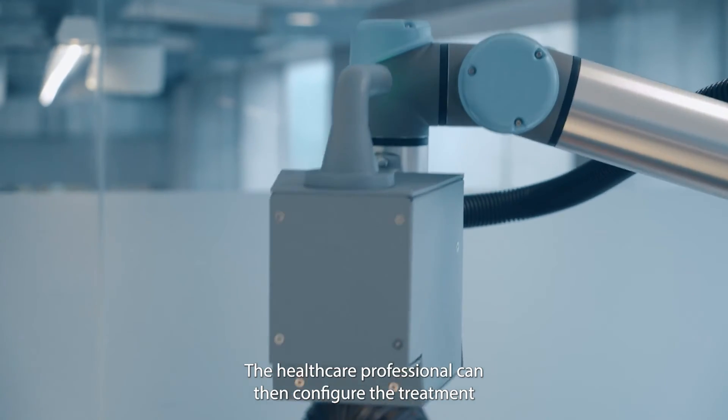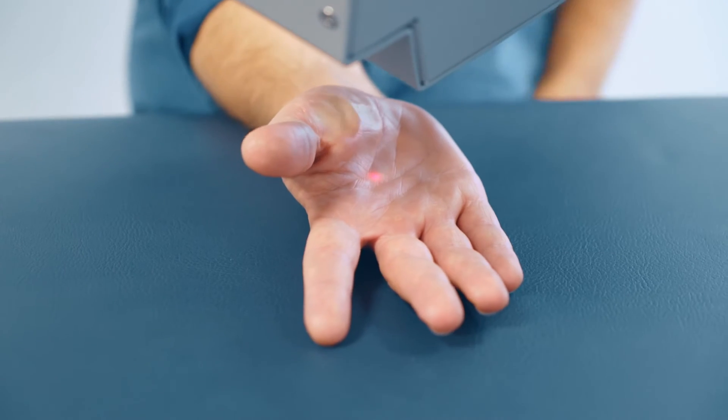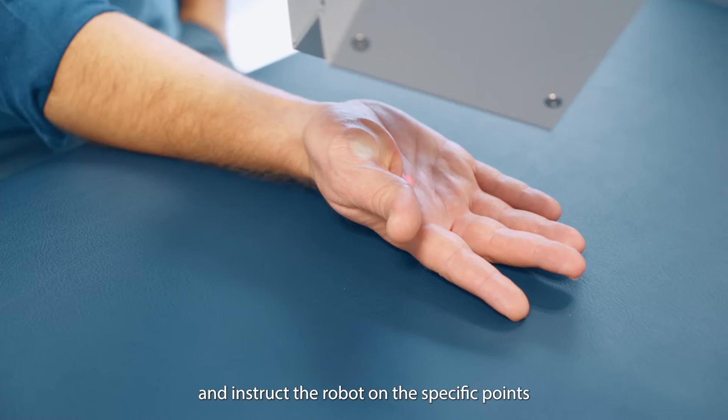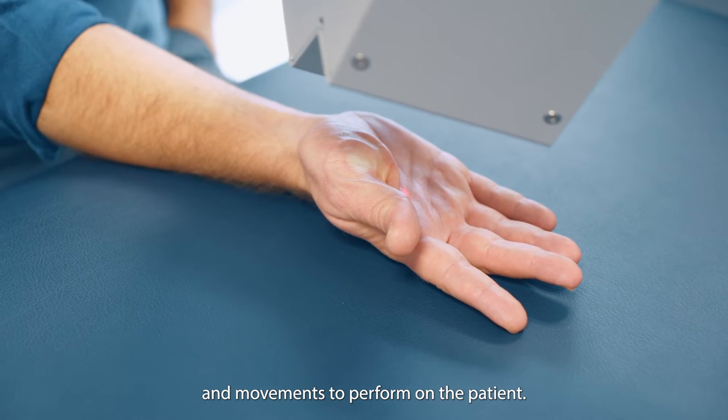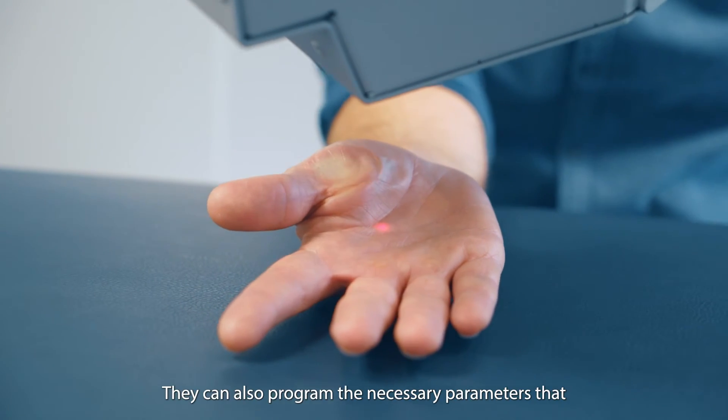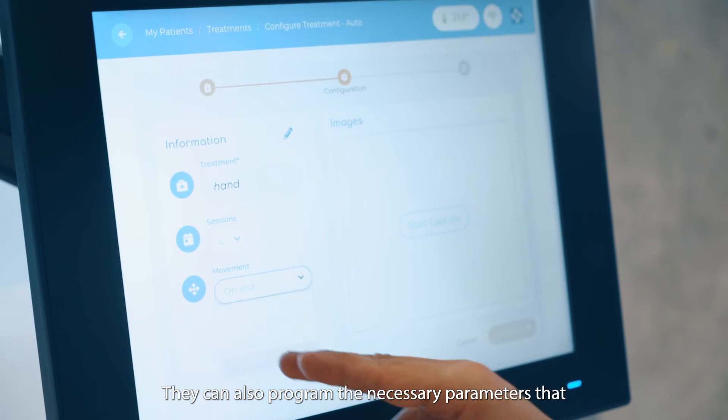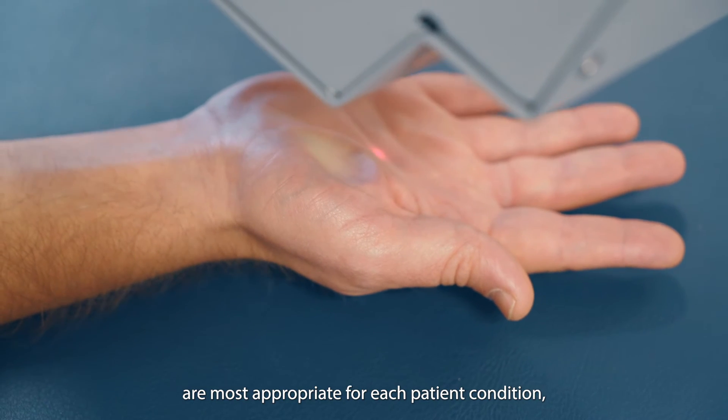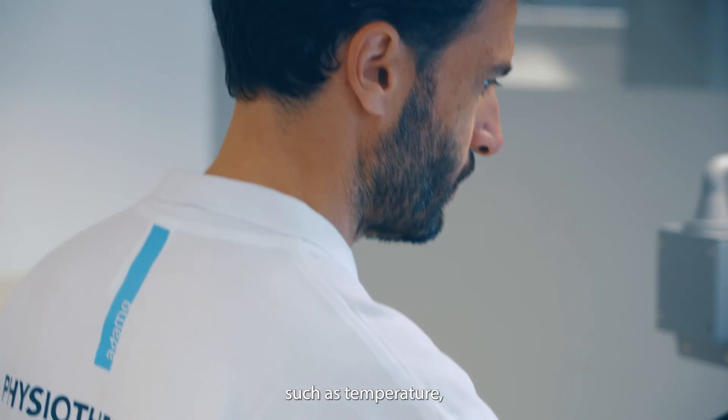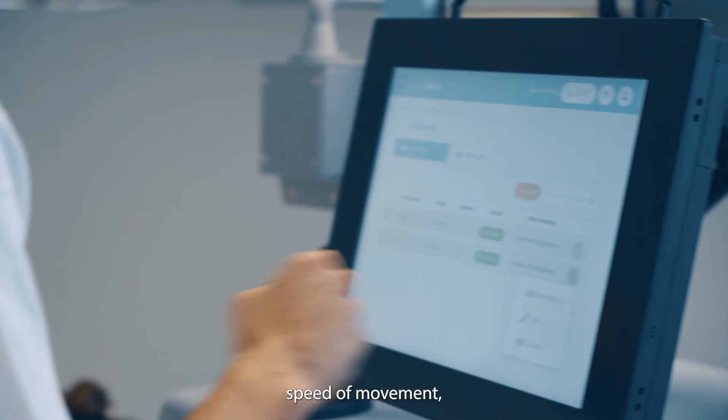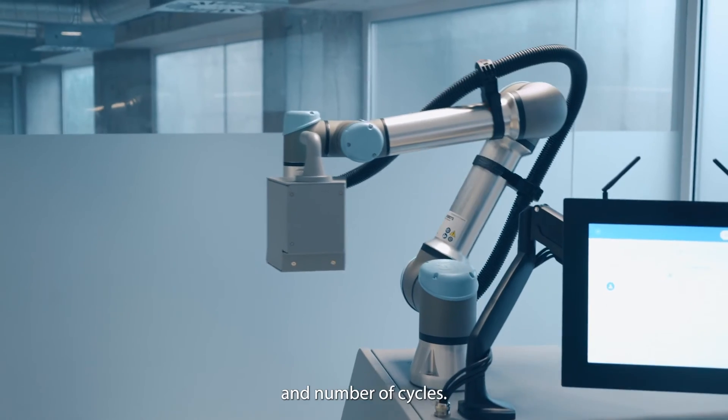The healthcare professional can then configure the treatment and instruct the robot on the specific points and movements to perform on the patient. They can also program the necessary parameters that are most appropriate for each patient condition, such as temperature, speed of movement, treatment duration and number of cycles.